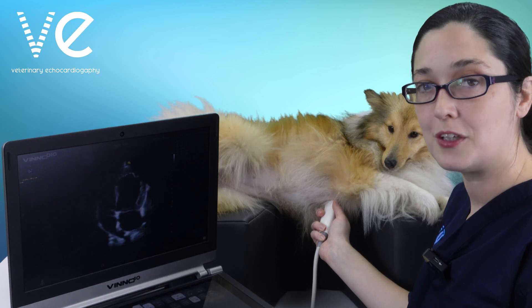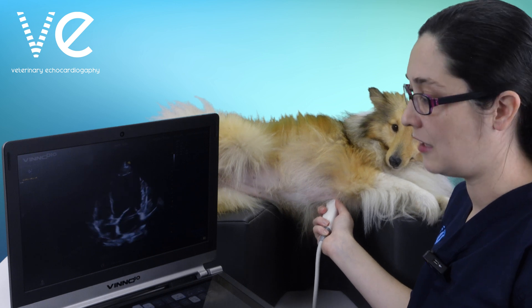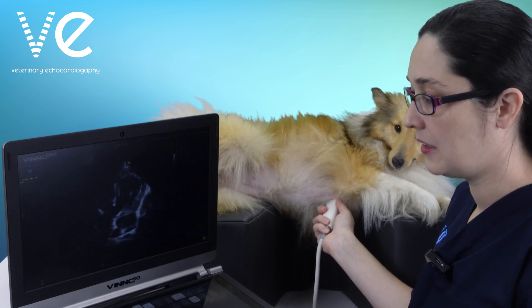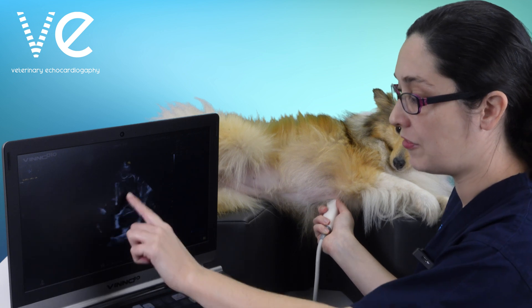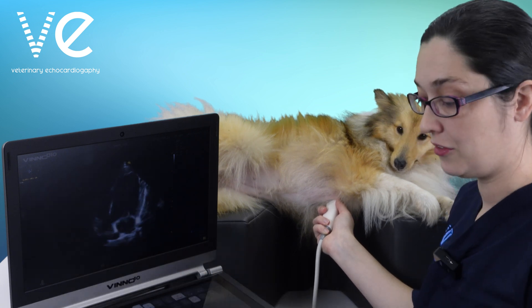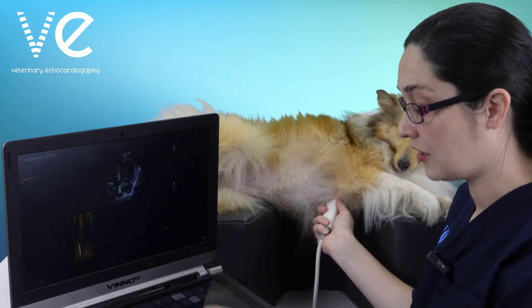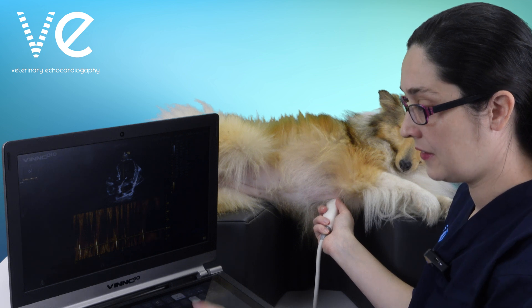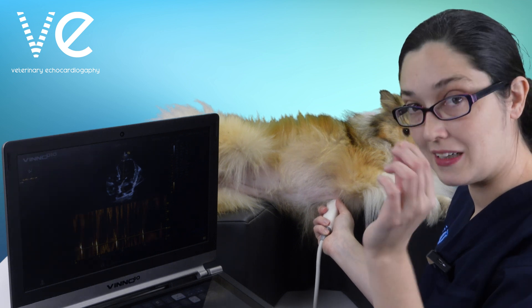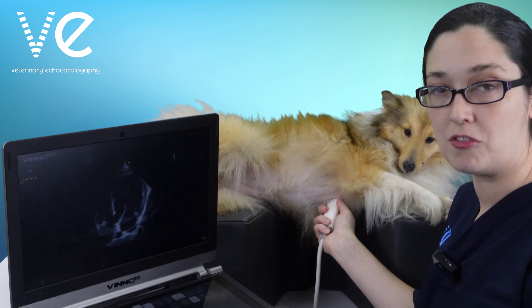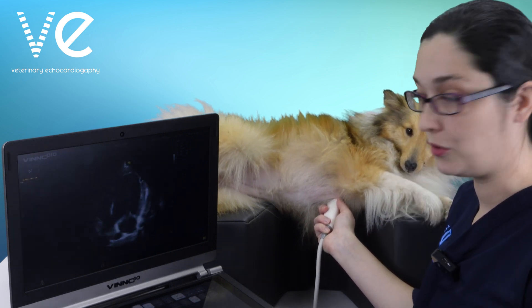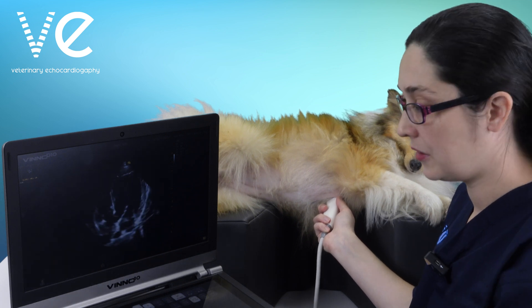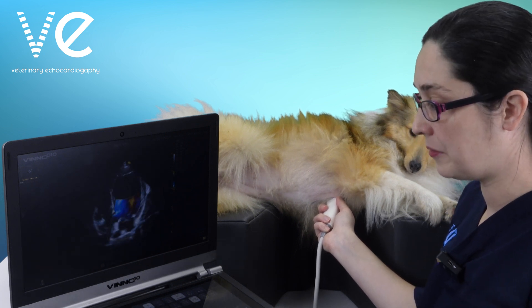From my apical four-chamber view, I'm going to lift the tail of my probe slightly to give myself a bit of a five-chamber view. What I want to do is catch the inflow and the outflow. First thing I'm going to do is just increase my sample volume a little bit. I don't want a really tiny, specific sample volume as we do usually with other types of traces. Then I'm going to use my colour Doppler to guide me.